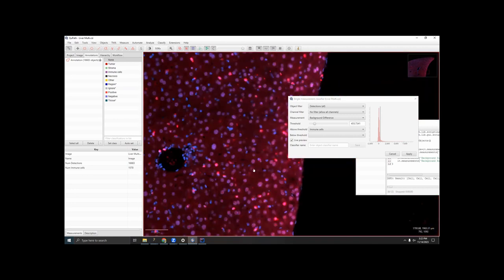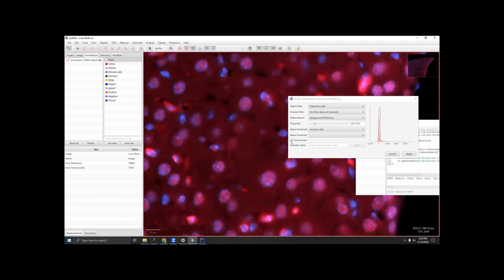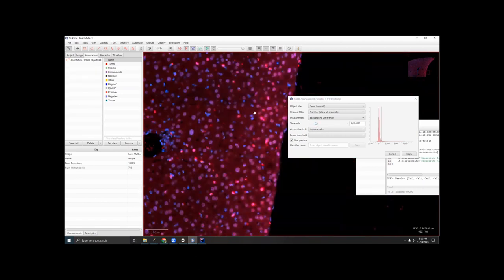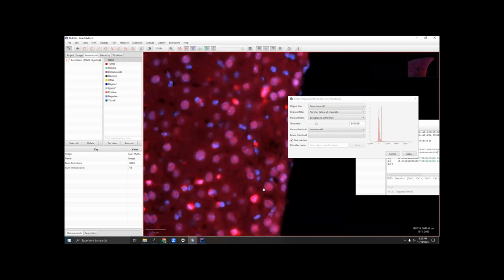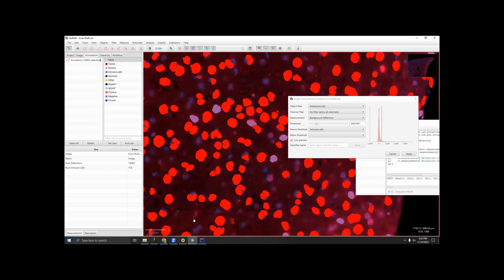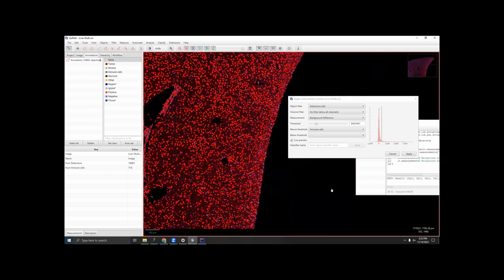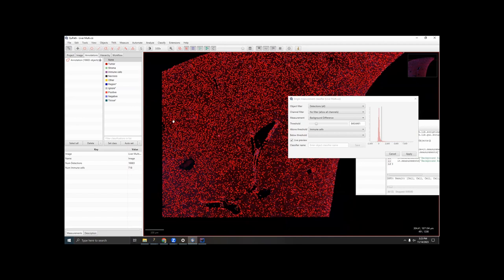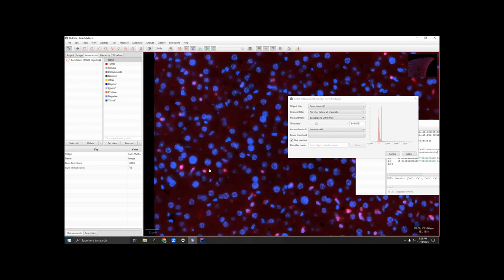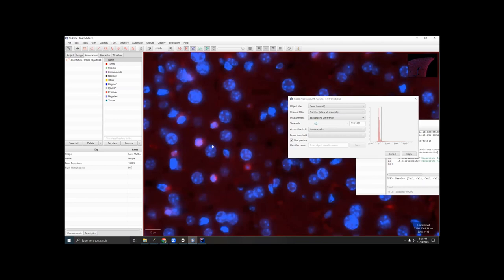Overall, over here it looks good. And let's go to the right side of the tissue. And that doesn't look great. Maybe it needs to be a little higher. Yeah. So yeah, now it's looking a lot more reasonable, where the purples are marking the positive cells for the most part. Oh, that's too high.